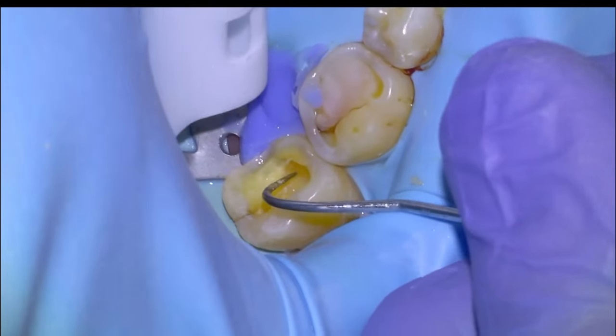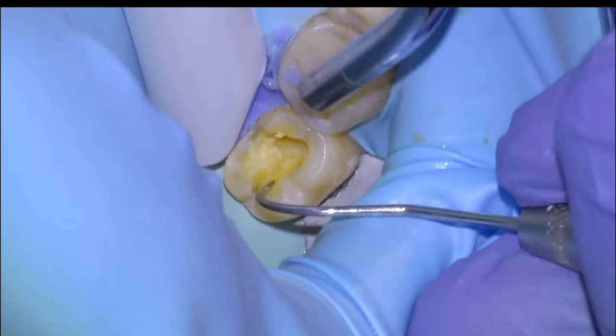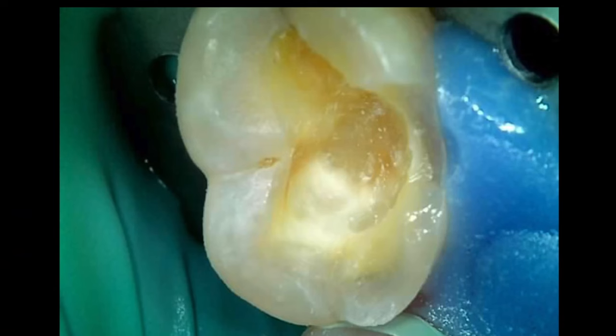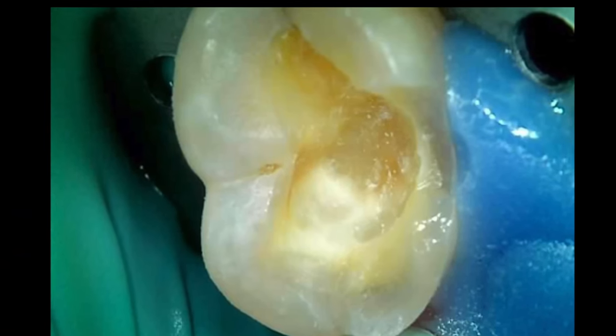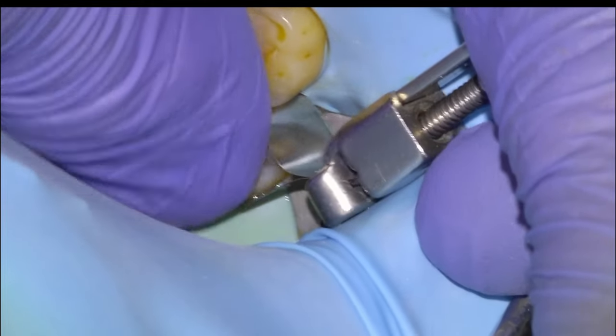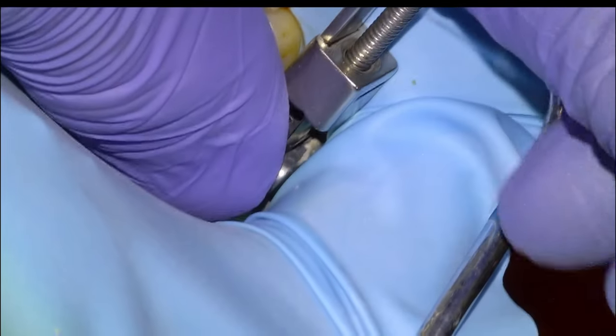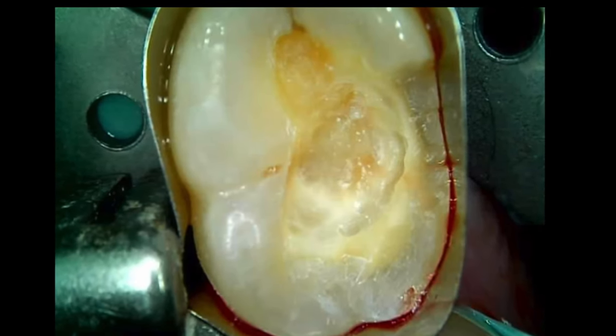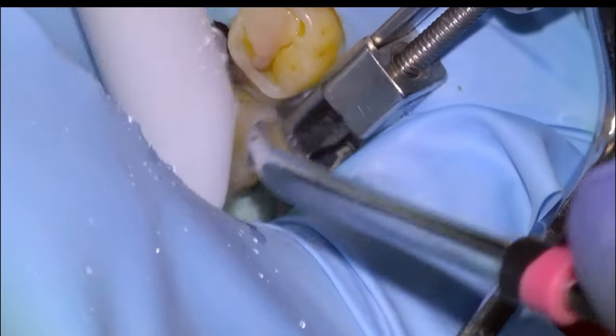We're going to check if there's any decay by just poking the dentin with an explorer. We wouldn't do this if we were anywhere close to the pulp, obviously. But once the tooth structure feels hard to the touch, we will get a Telfemeyer on — no need to use a sectional. Just going to lasso the lingual wall and then build it up from here.